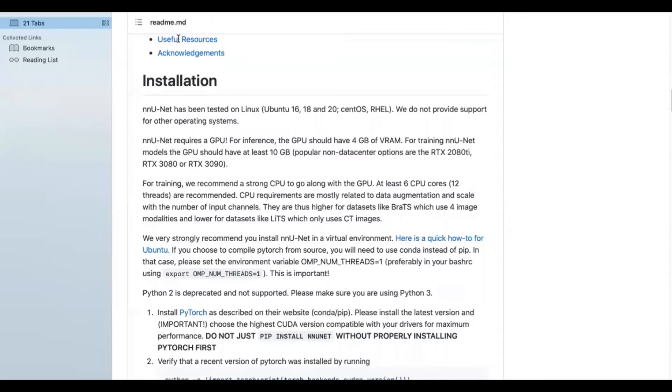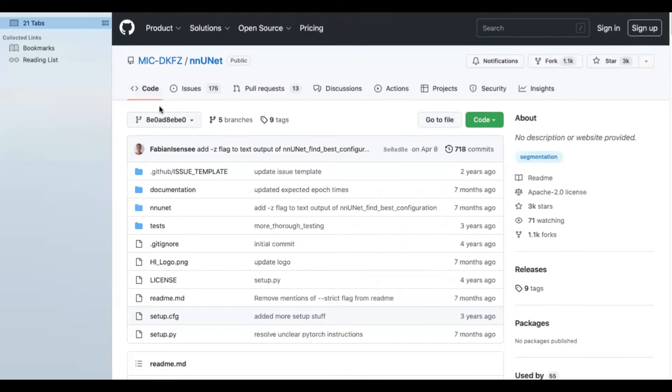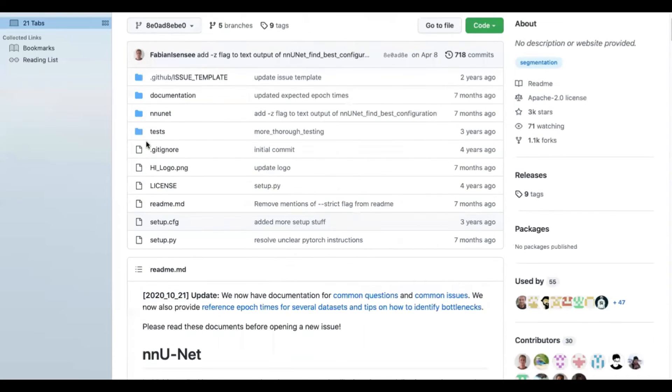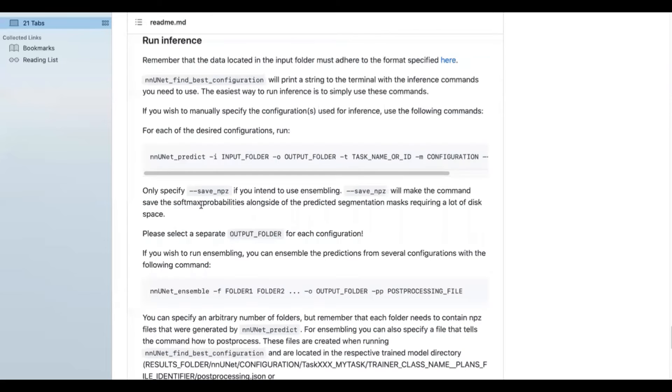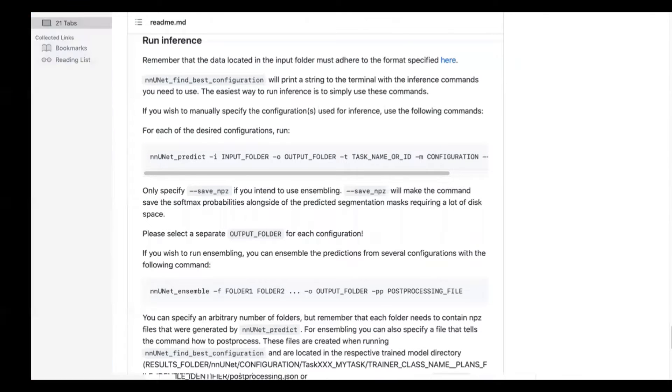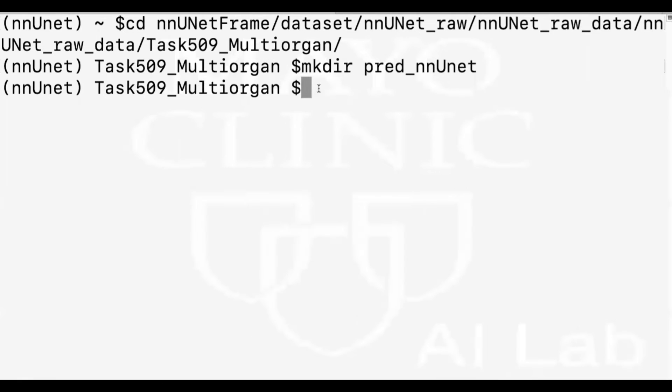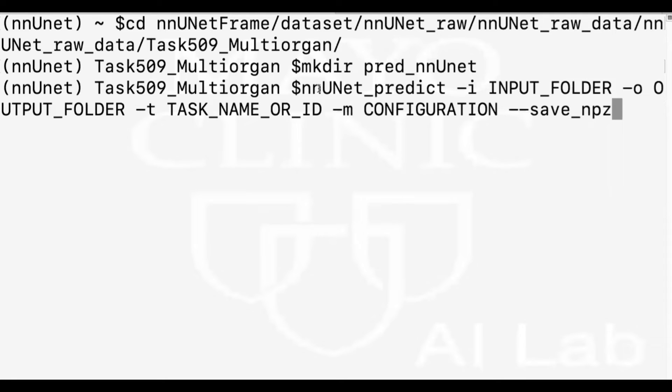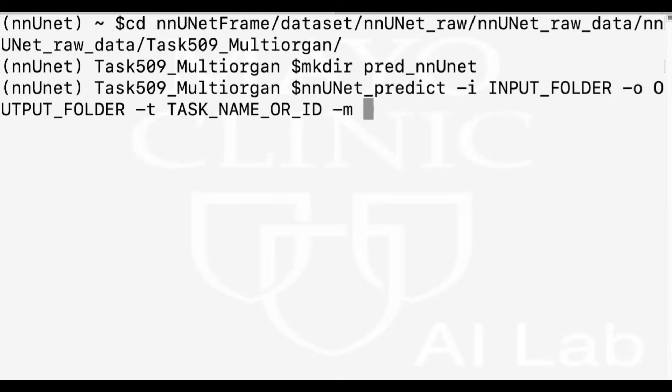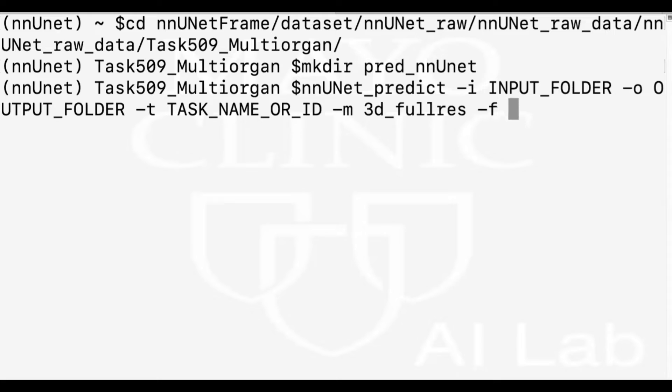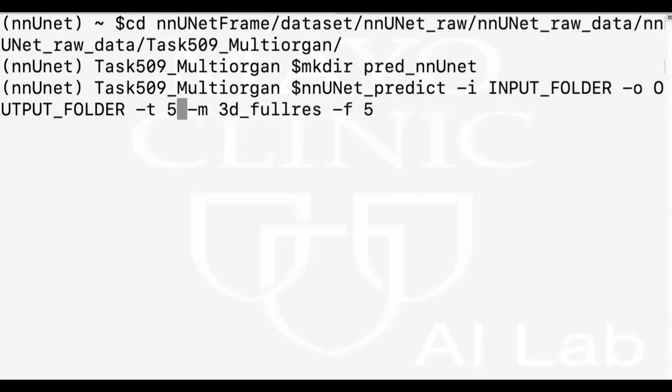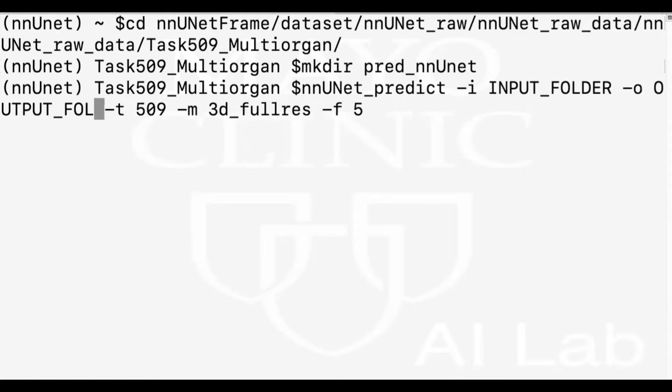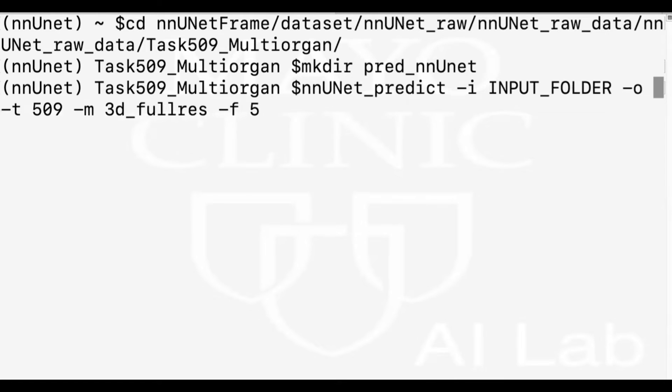Now we go to nnU-Net main page and click on run inference to find the command. And I'll copy this command and paste it into terminal. So the configuration can be 3D full res, it can be a 3D cascade, it can be 2D. Here I've trained a 3D full res and I choose fold number 5 and the task ID 509. And output folder would be the pred_nnUNet that I just created.